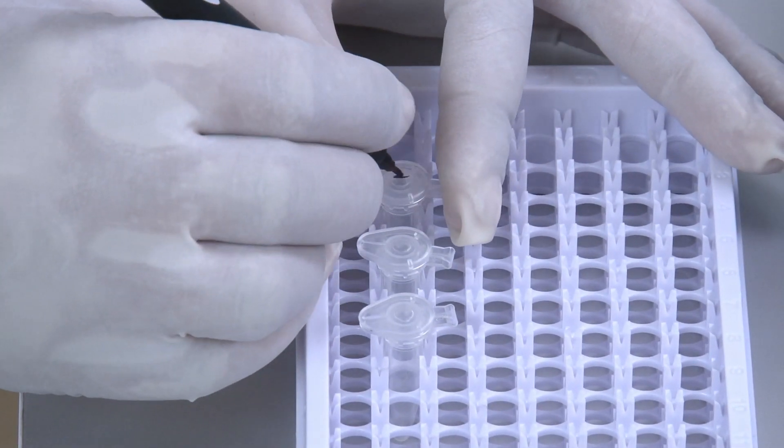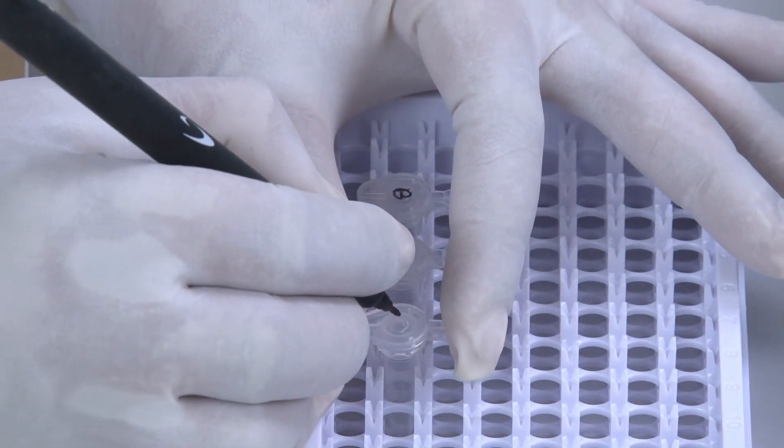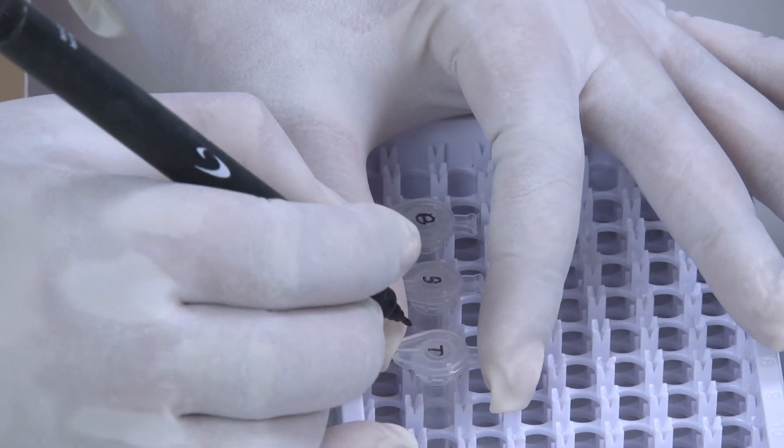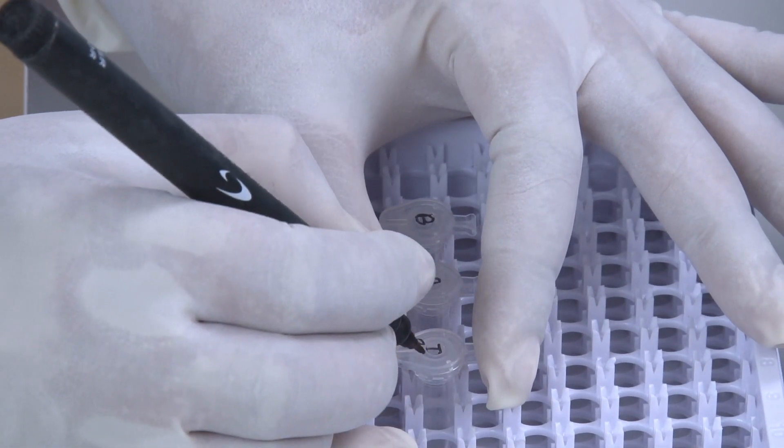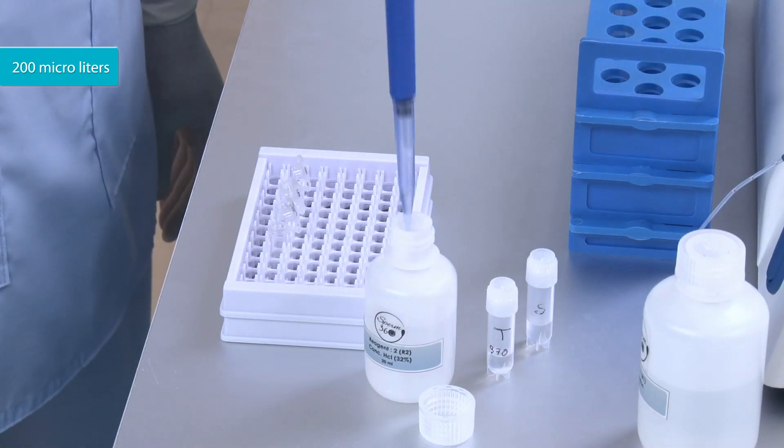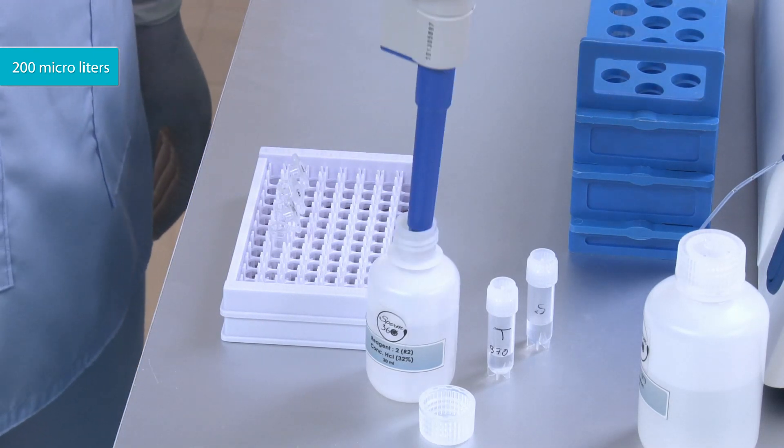Label them as blank, standard, and test with patient ID. Put 200 microliters of Reagent 2 to all three tubes.